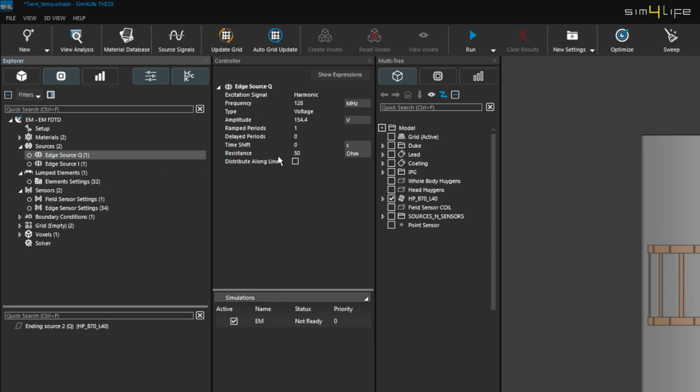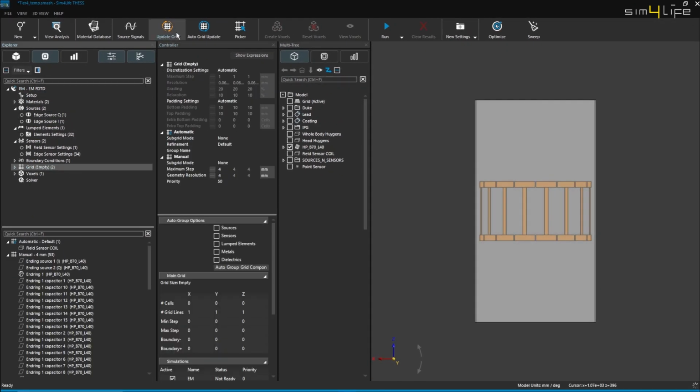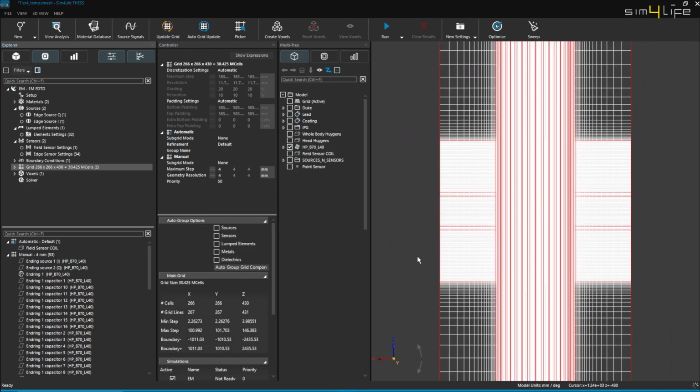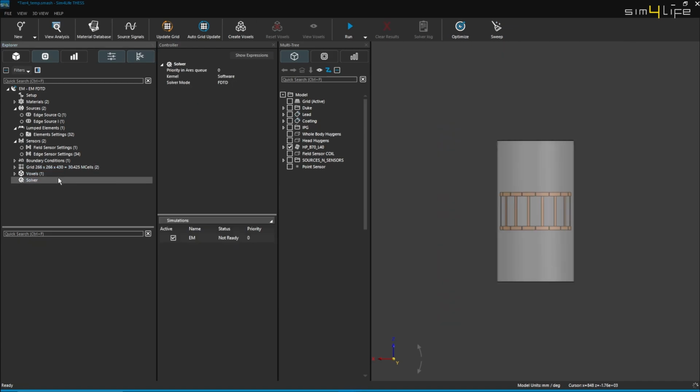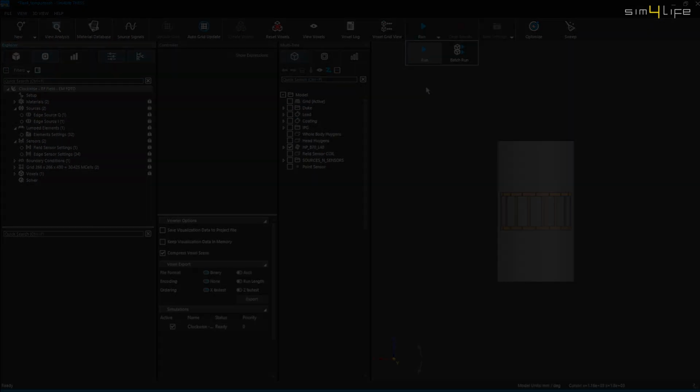We configure the I and Q edge sources in Sim4Life and time shift the Q signal by a quarter of the period to achieve the correct phase difference. This setup accurately models the clockwise circular polarization, commonly used in MRI systems. After configuring the grid and assigning all coil components as perfect electrical conductors, with capacitors placed as lumped elements, we proceed to the solver. We switch the default software kernel to CUDA to utilize GPU acceleration for faster calculations. Finally, we rename the simulation to clockwise RF field, create the voxels, and run it.